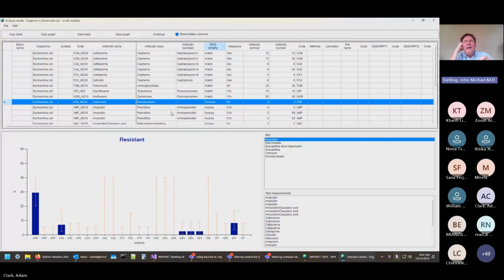So how do we get people to choose ampicillin instead of imipenem in bacteria that are ampicillin susceptible? One is to hide the imipenem result. It's called suppression reporting, selective reporting, cascade reporting. That's one way, is just don't tell them the imipenem result. Another way is put dollar signs, $1 sign, $2 signs, $3 signs to indicate expense.